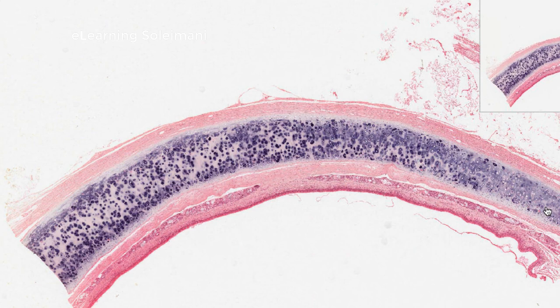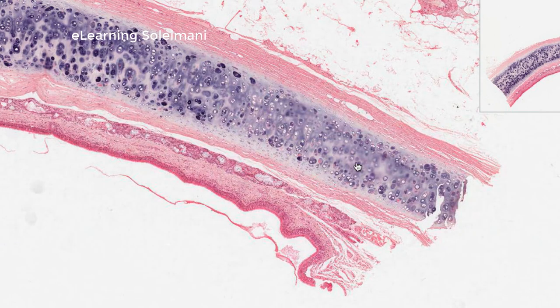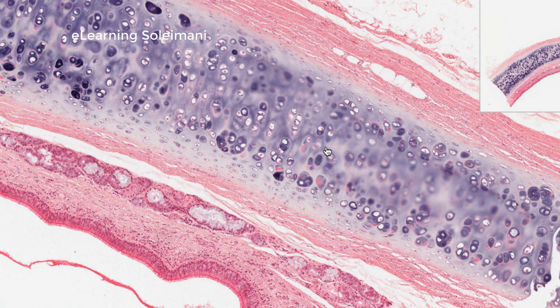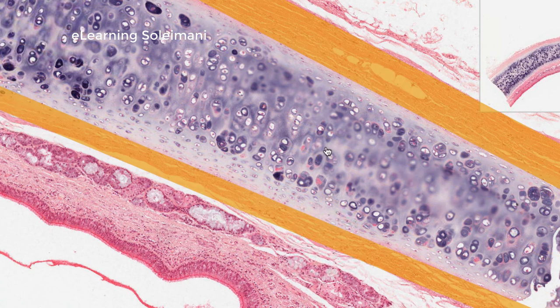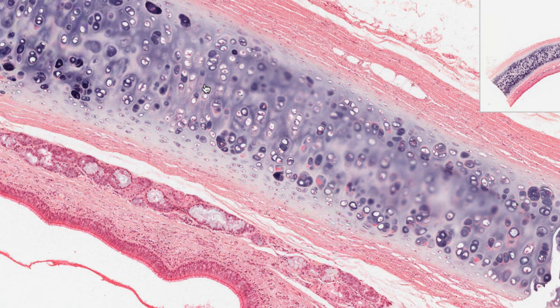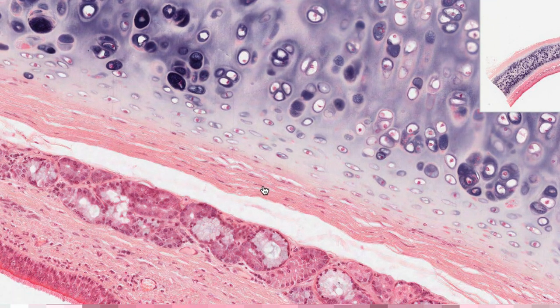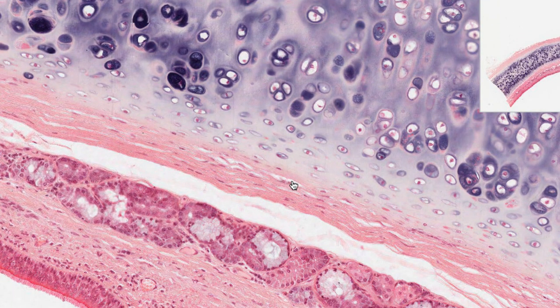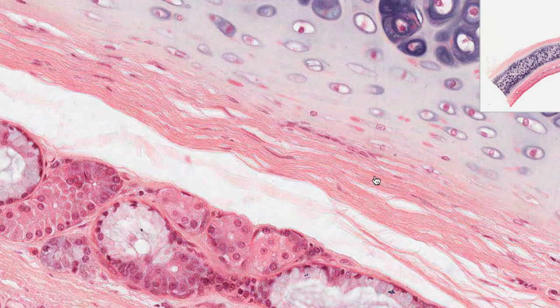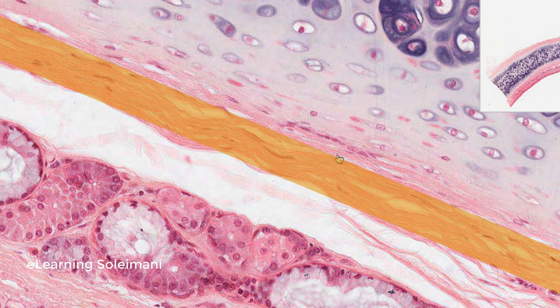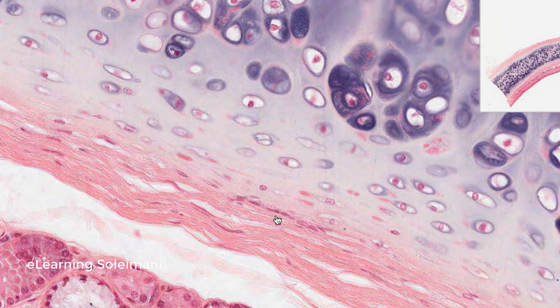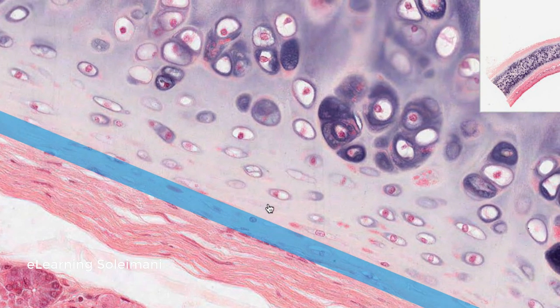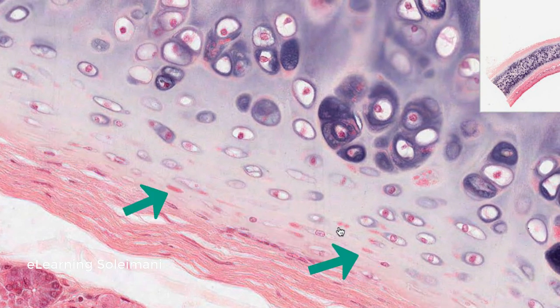This slide shows the trachea, used here to teach hyaline cartilage. With higher magnification you can see the cartilage. The perichondrium is a layer of dense irregular connective tissue that surrounds the surface of hyaline cartilage, and it is made up of two layers: an outer fibrous layer containing fibroblasts and collagen fibers, and an inner chondrogenic layer containing chondroprogenitor cells.